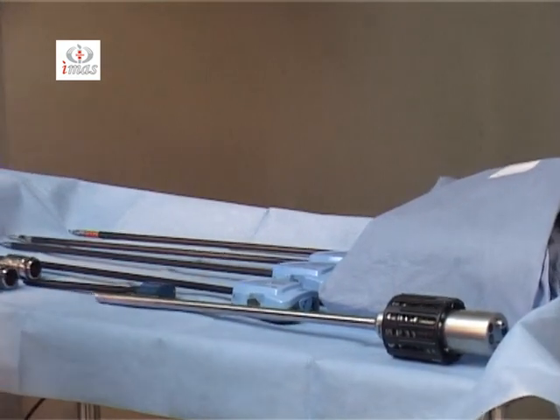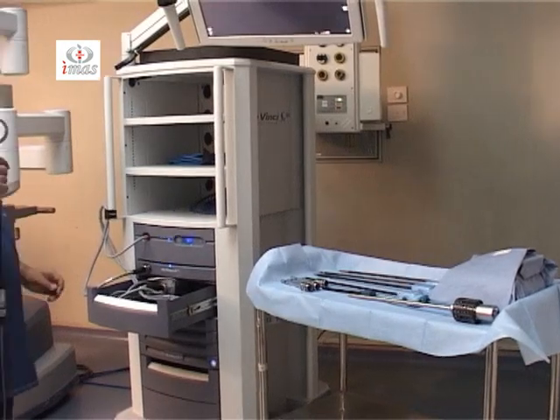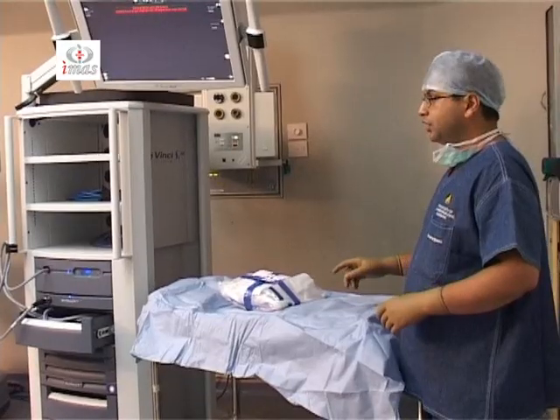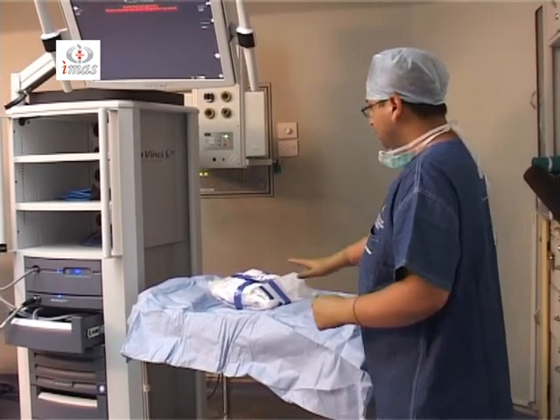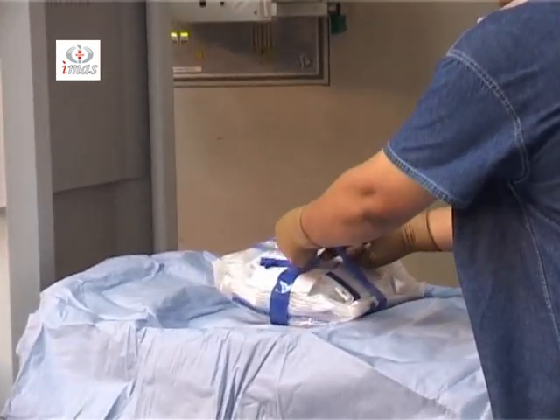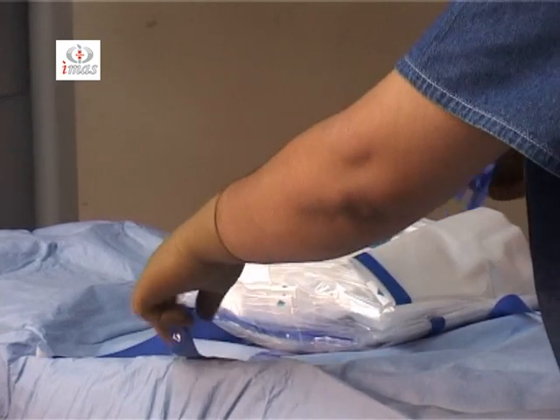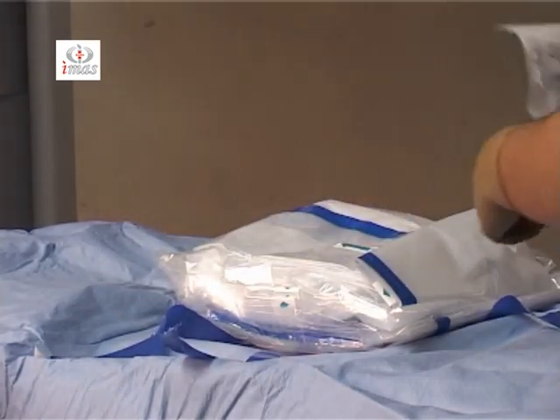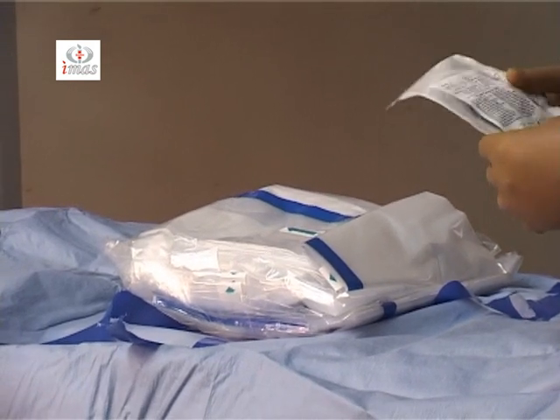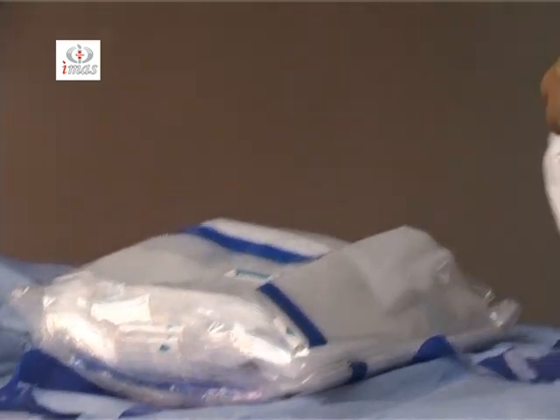So we'll show you how to assemble the camera, how to drape the patient cart, and how to dock the robot. Coming to the draping of the robotic system, these are sterile drapes provided by Intuitive Surgical. They have to be opened. This is a 3-arm drape, in which there are 8mm cannula seals which have to be opened to place on the ports.